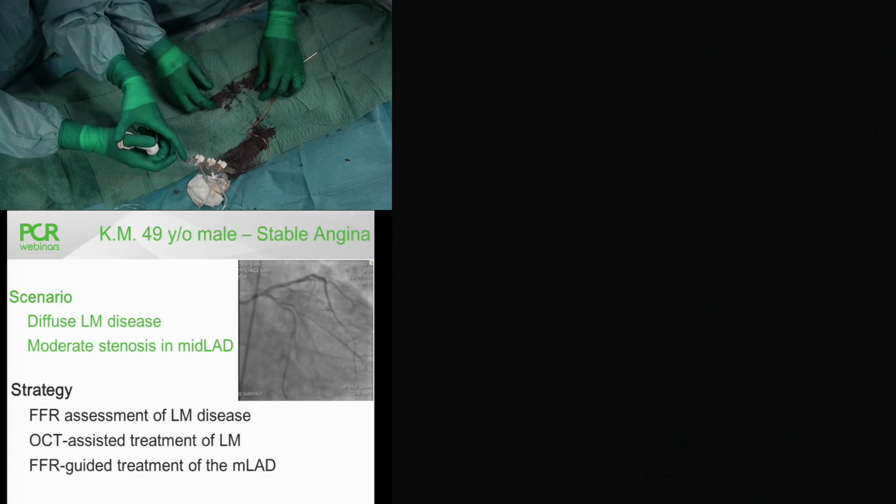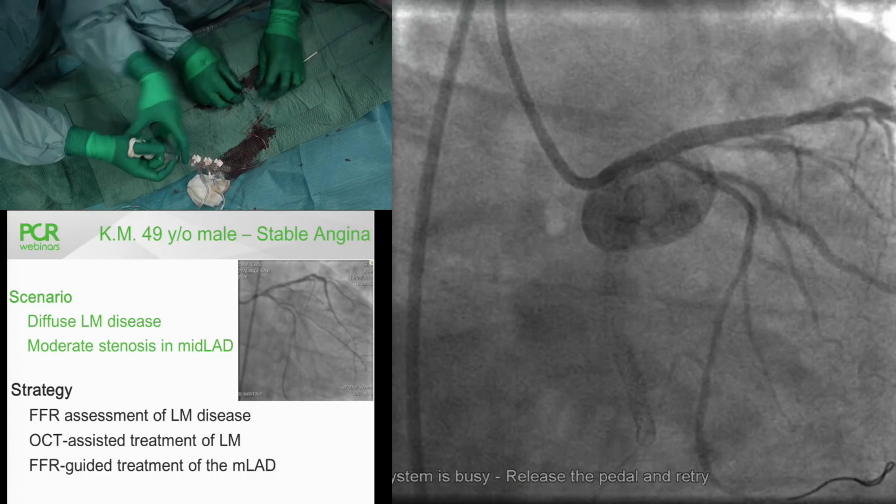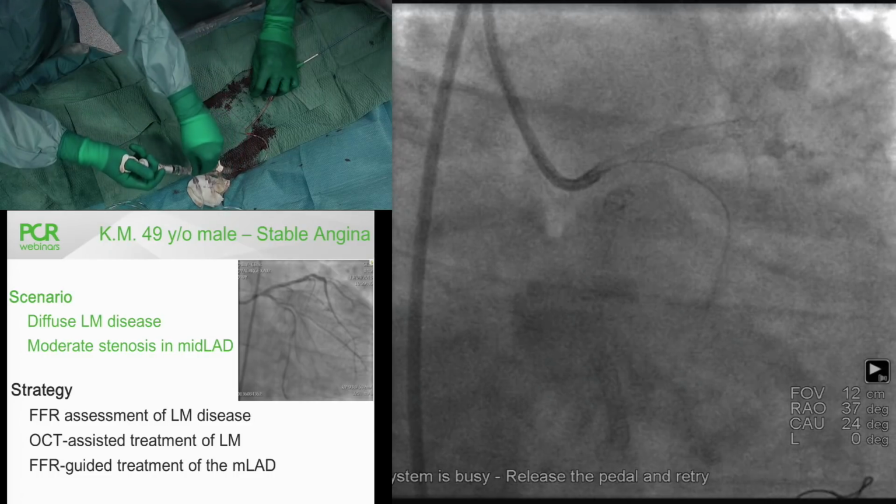Patient has ST elevation, which was partially present in the beginning, but maybe a little bit more now.